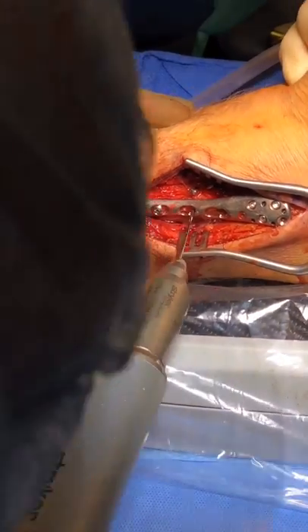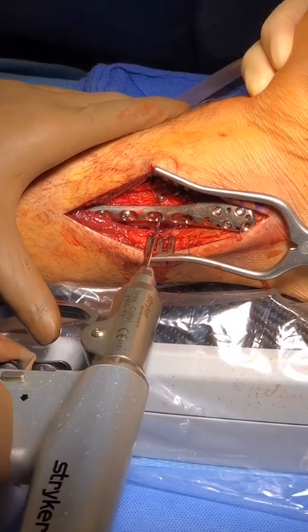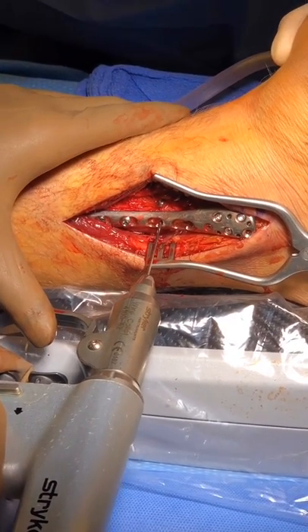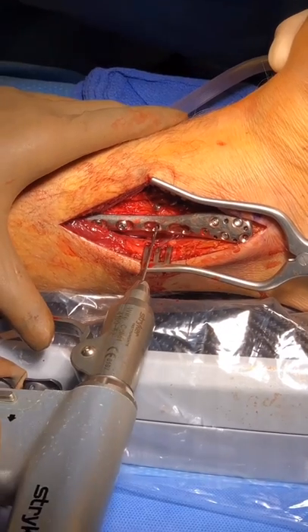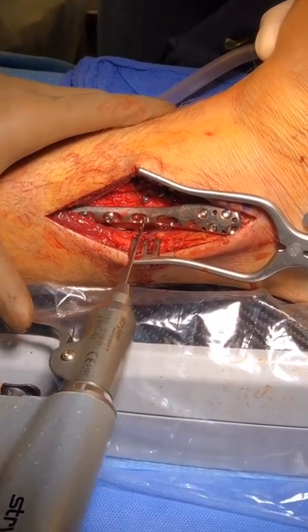So with the aid of fluoroscopy, we will make sure we're parallel to the joint line and aiming approximately 15 degrees posterior to anterior. And we will advance the K-wire.